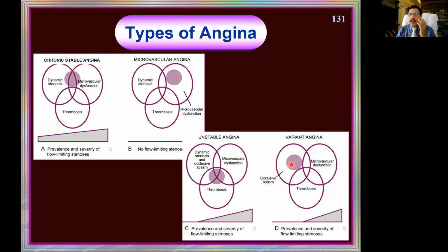ECG shows transmural effect. That means the ST segment is elevated, but within no time, it comes back. We had several patients whom we thought had infarction. We admitted them, and within a few minutes to 1 hour, the ECG has become normal without much treatment. No revascularization is done. And remember, if you do enzymes here, they are normal, because there is no injury, there is no infarction.